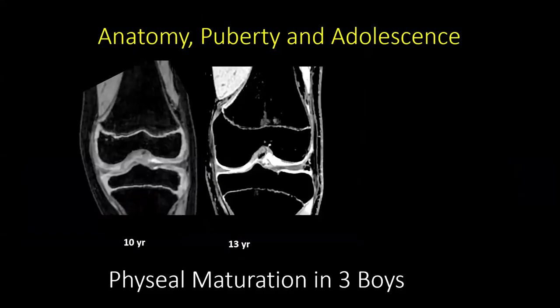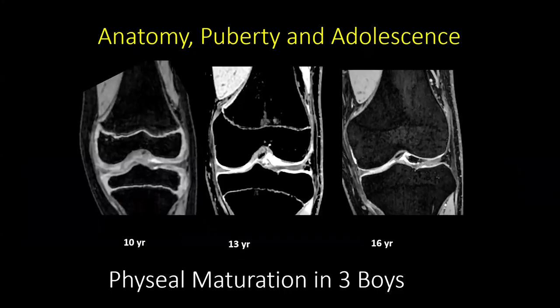But then the most interesting part is that we have this growth plate that we can see. It becomes smaller when we reach puberty, but then somehow it ceases and disappears. So something is working here, and it is probably something that we can measure.